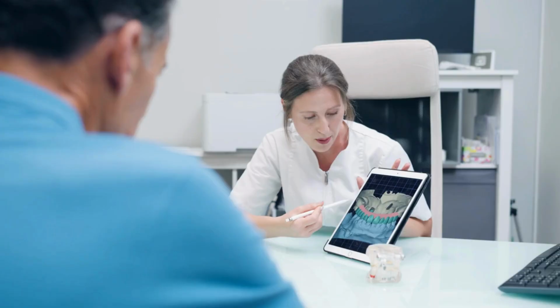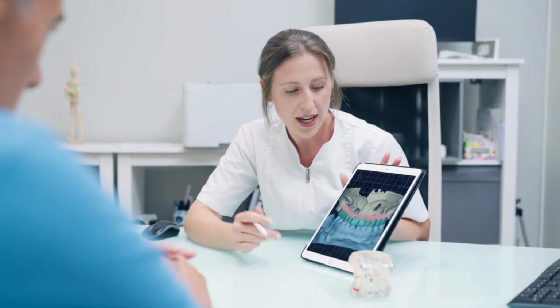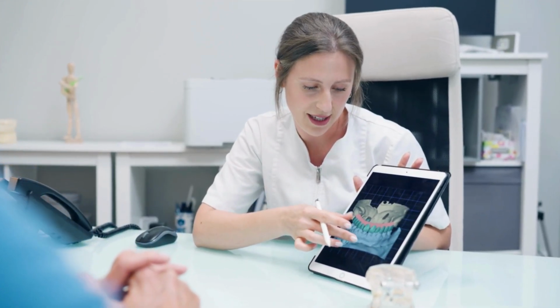The design software. This is where you become the architect of the smile. You aren't guessing anymore. You're designing the occlusion, margins, and anatomy on a 3D model before a single piece of material is touched. The milling/3D printing.